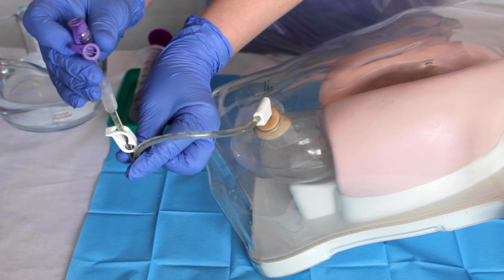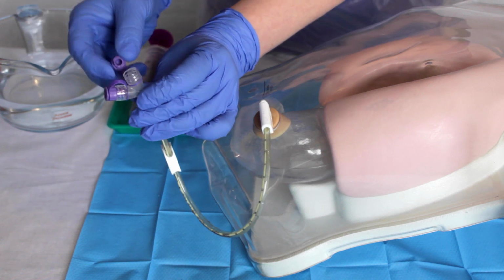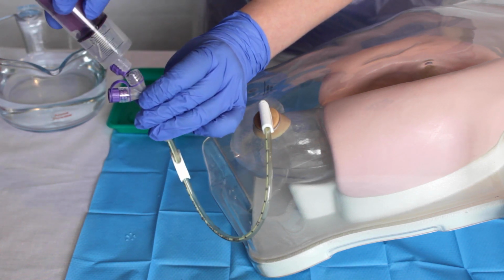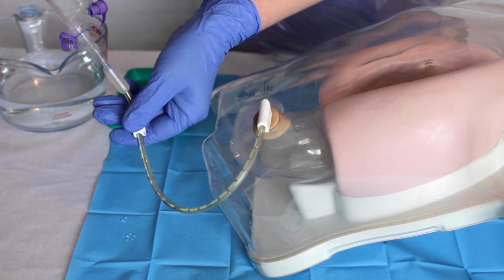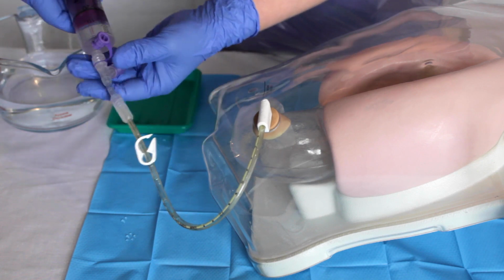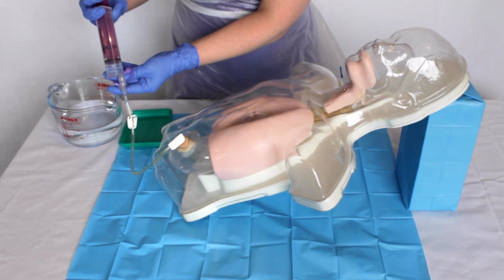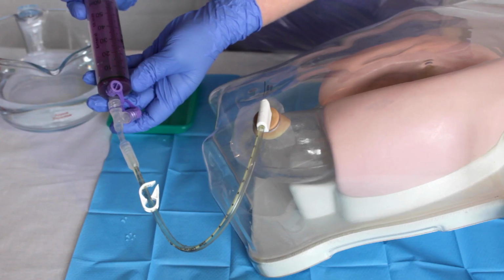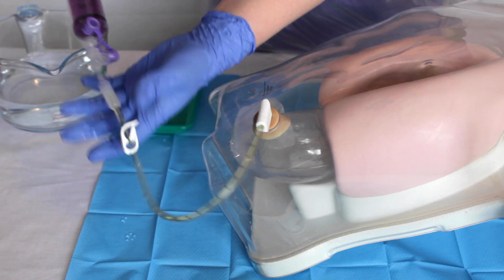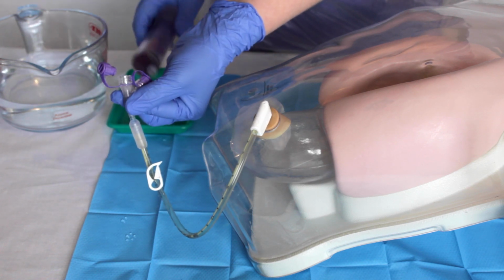Connect the syringe to the feeding tube, being careful not to over-tighten, and open the clamp or release the kink between your fingers. Slowly push on the syringe plunger to flush the tube with the required volume of water. Close the clamp from the feeding tube or kink your fingers before disconnecting the syringe.